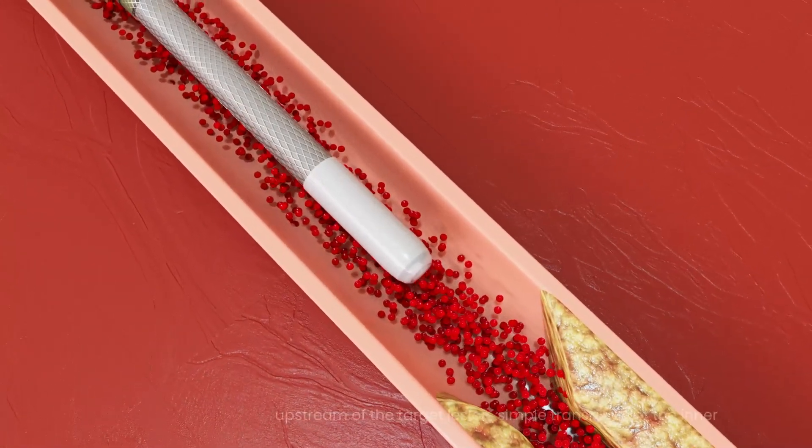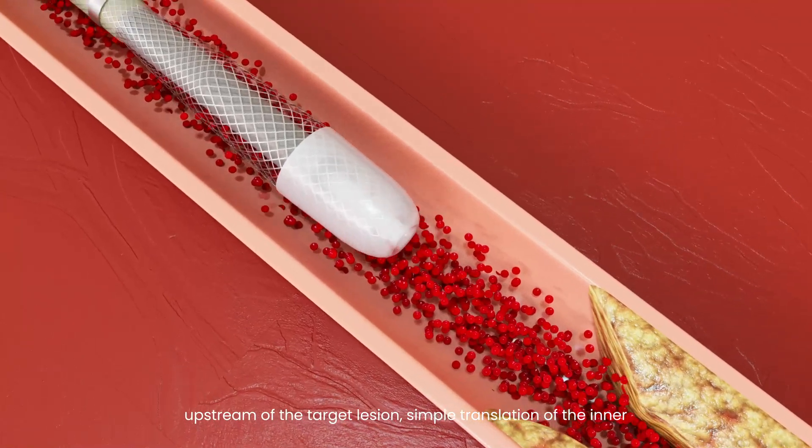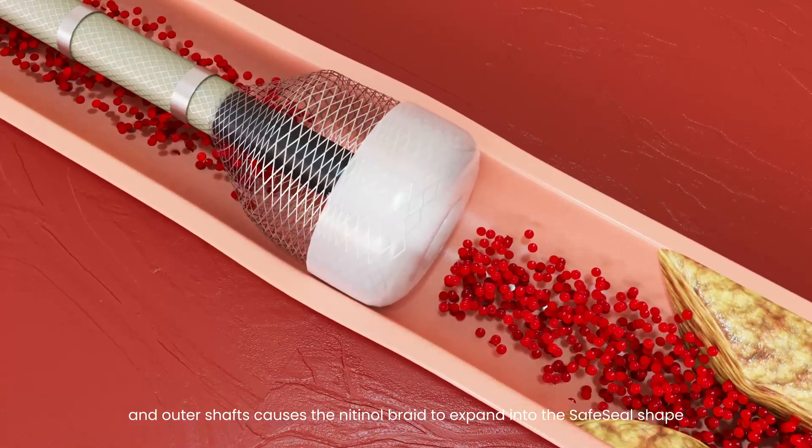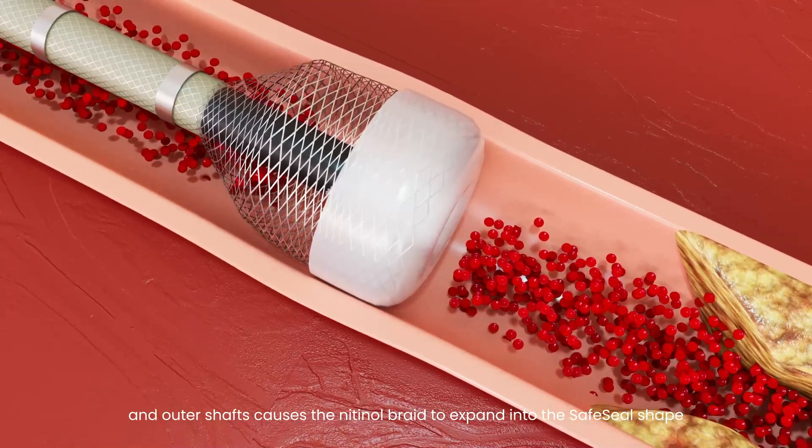After placing the catheter just upstream of the target lesion, simple translation of the inner and outer shafts causes the nitinol braid to expand into the safe seal shape.